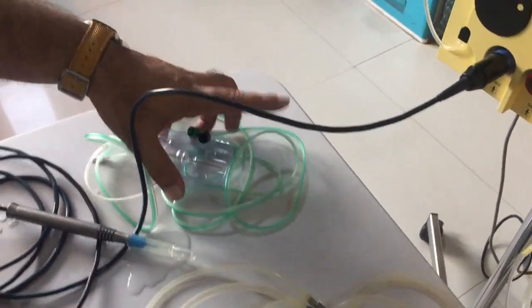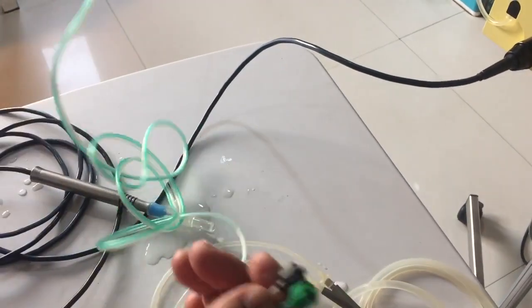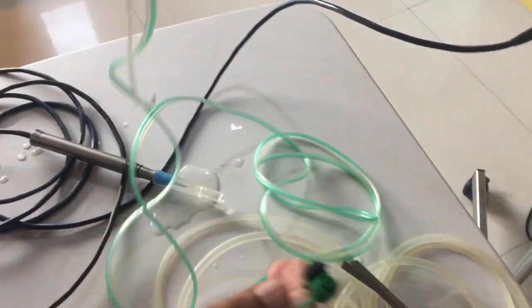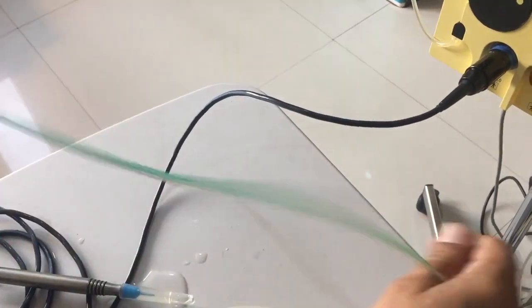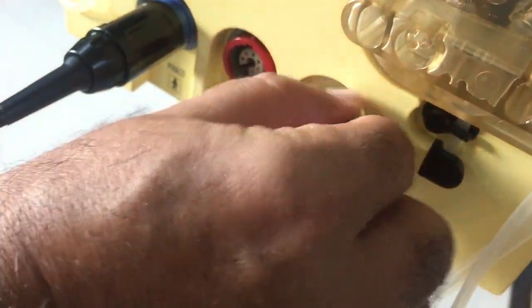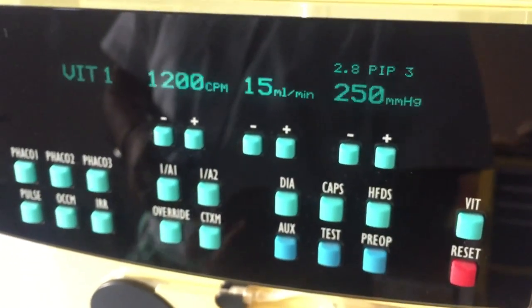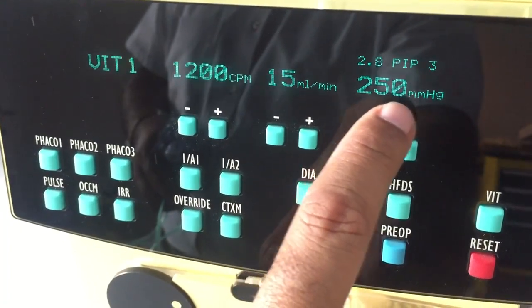And during this surgery, if you need some vitrectomy, if you have a capsule rupture during the surgery, you can use this vitrectomy handpiece. This is the cutter, and here are the two pipes going to the machine, and here are the two ports on the machine. One is the green and one is the black. So you can connect the green with green and black with black tightly, and to select the function of vitrectomy here. Vitrectomy. Here are the settings for the vitrectomy: 1200 cuts, 15 ml per minute flow rate, and 250 is the vacuum for the vitrectomy.